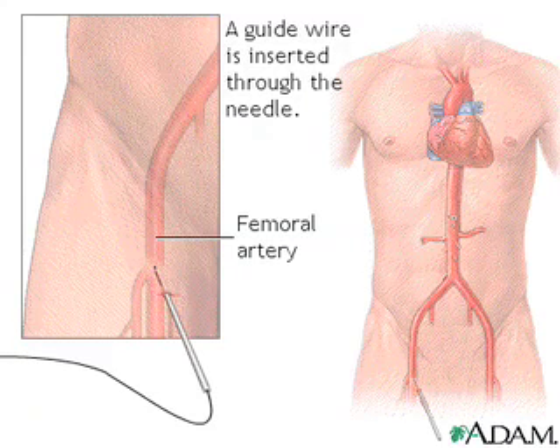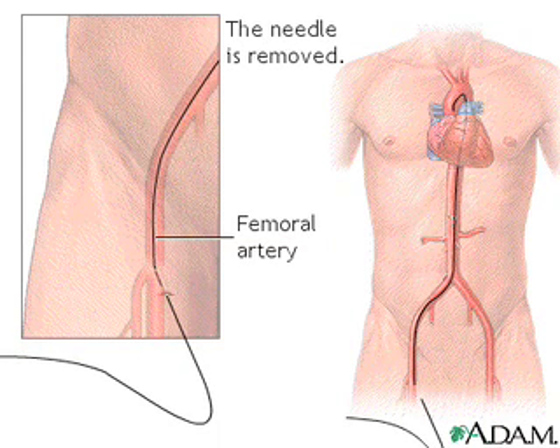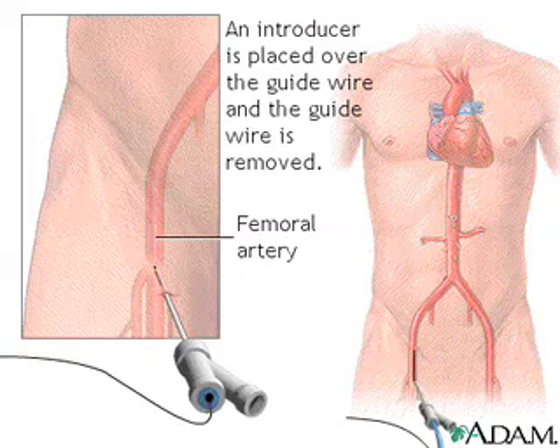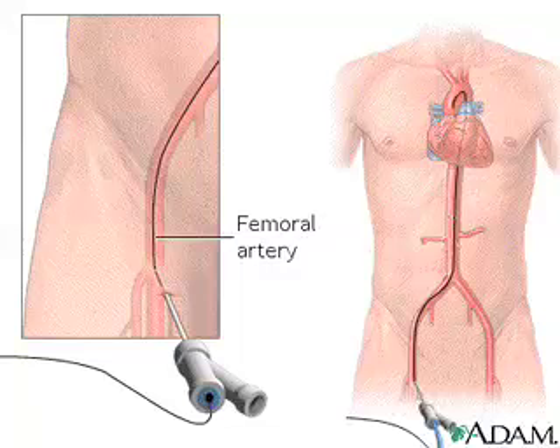Once the needle is inserted, a guide wire is placed through the needle into the blood vessel. Following this step, the guide wire is left in the blood vessel and the needle is removed. An introducer is then placed over the guide wire, after which the wire is removed, and a .035 thousandth inch guide wire is put in its place.